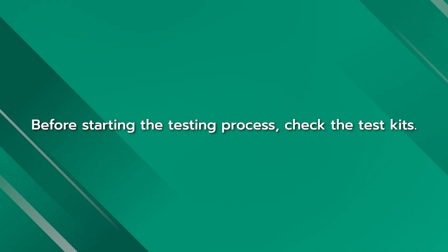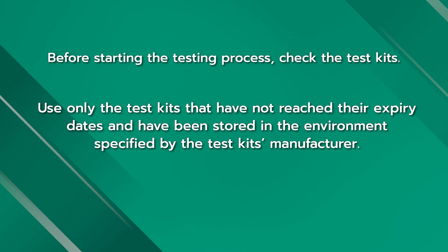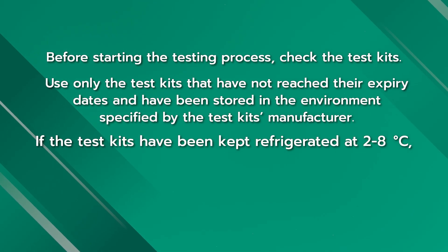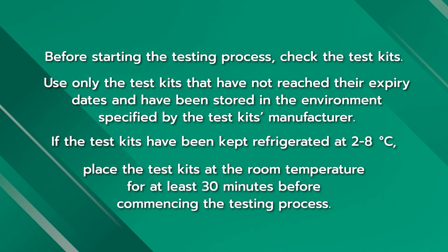Before getting started, check the test kits. Use only unexpired test kits that have been stored in the specified temperature range of 2–30 degrees Celsius. If the test kits have been kept refrigerated at 2–8 degrees Celsius, place them at room temperature for at least 30 minutes before commencing the testing process.